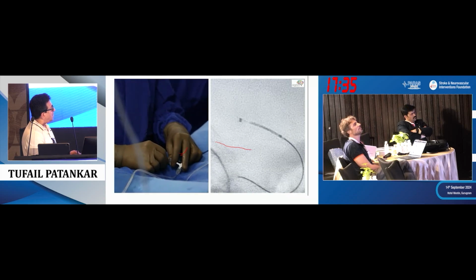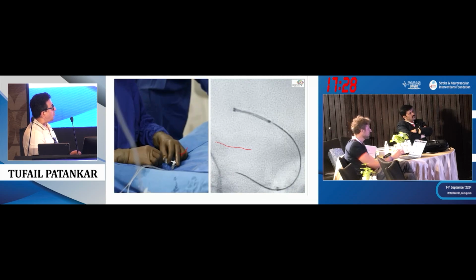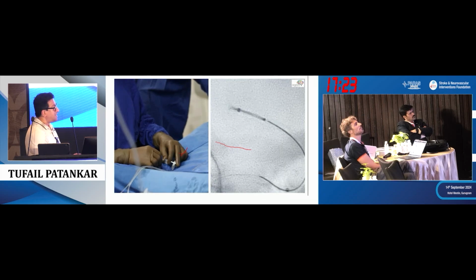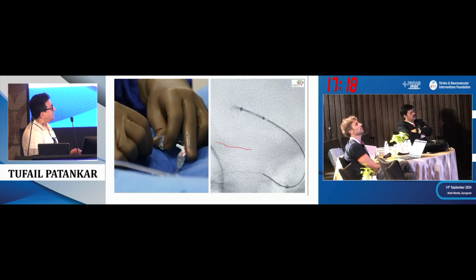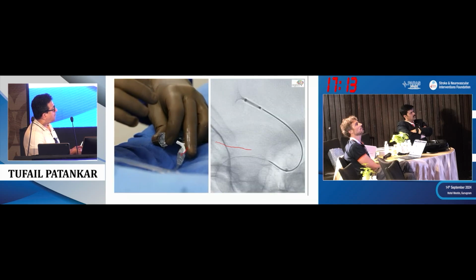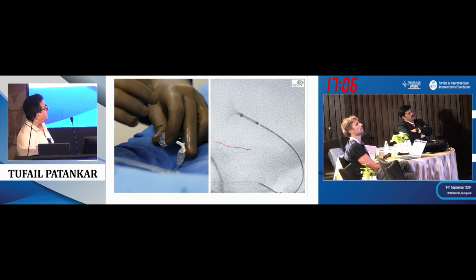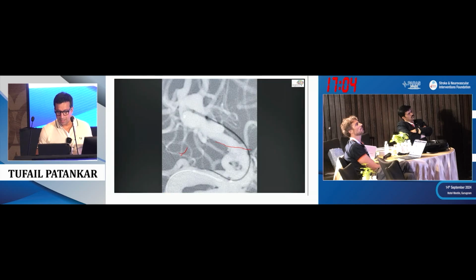As you can see now, the device is coming in. The catheter will self-center if it needs to. If it's touching the wall around, I wouldn't get too hassled. I've never seen a rupture with this device directly because of the device. And then you can do a very similar technique, a little bit of a push, open it, push and pull. As you can see now, it's opening up, and then you can see again, as he's unsheathing it.